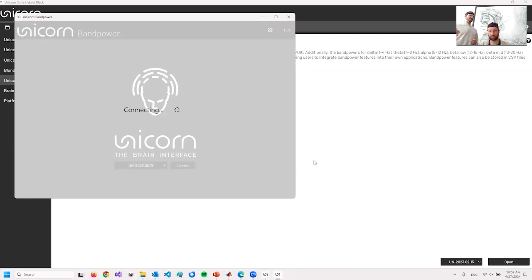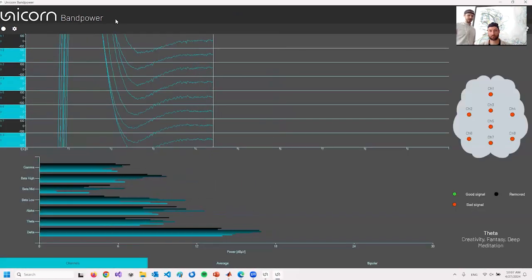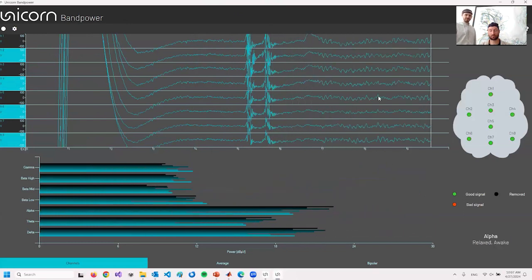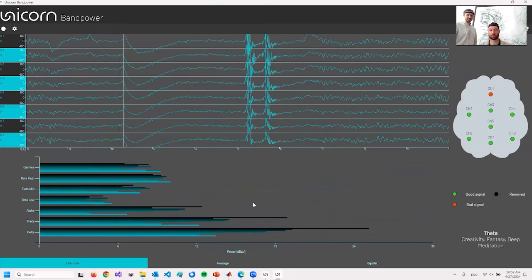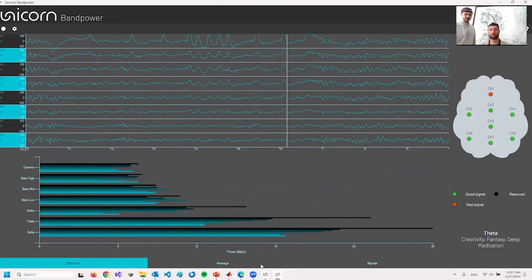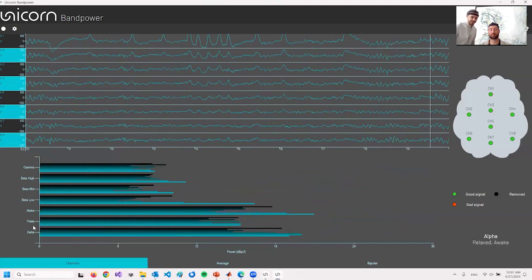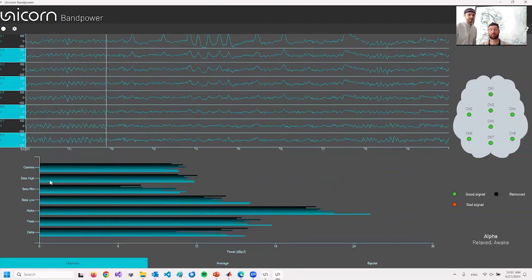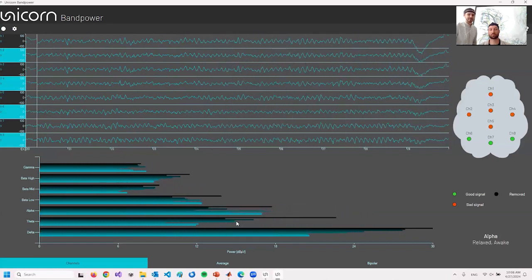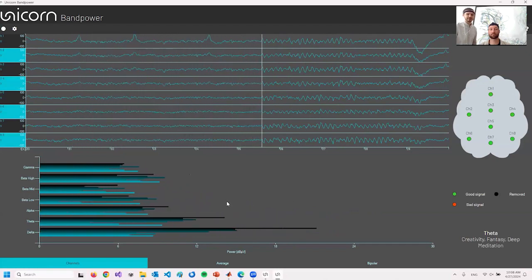As mentioned before, there are different frequency bands, and with the Unicorn band power, you can measure all of them. So you can see right now Leo closed his eyes and the alpha band immediately rises, and as he opens the eyes, the alpha band drops again. On the bottom channel, you can see all the frequency bands ranging delta, theta, alpha, beta, and gamma. And you can see all the 8 channels. Right now, Leo has very big alpha waves, and alpha was most present. Then he opened his eyes and alpha went away.